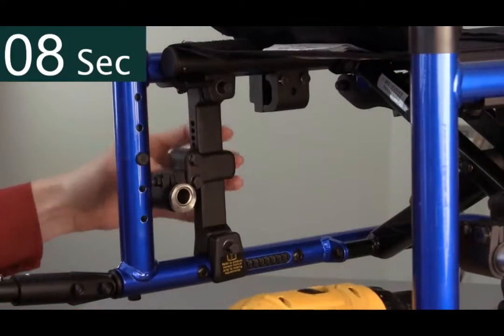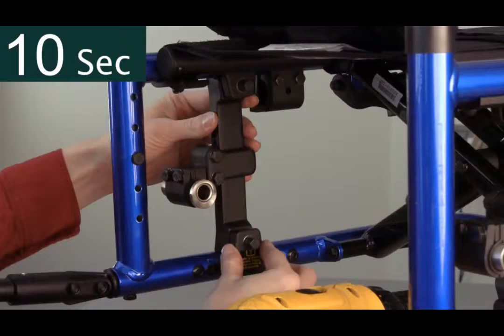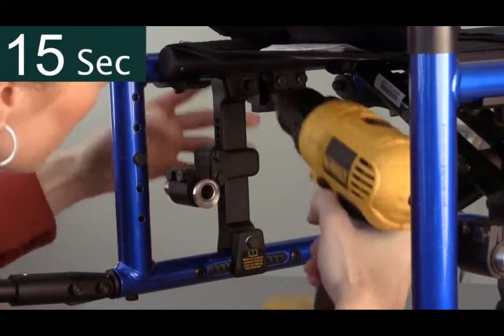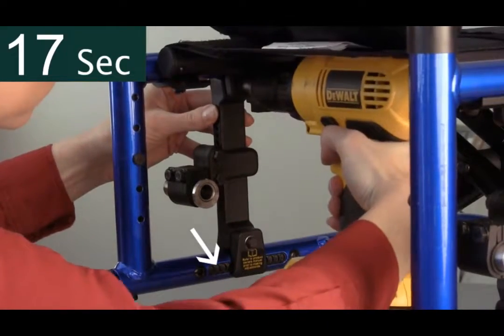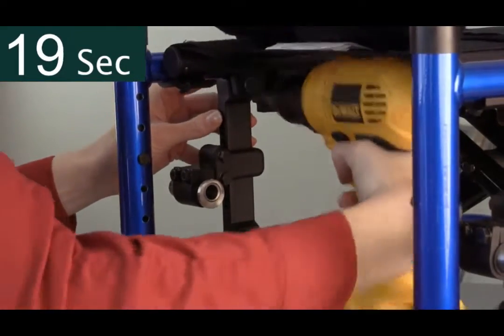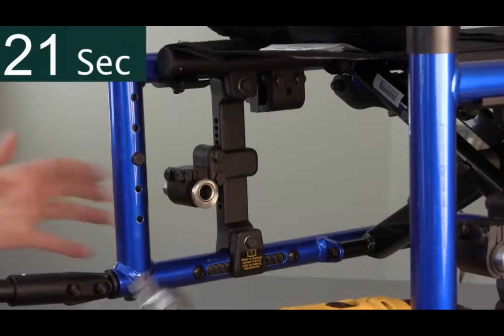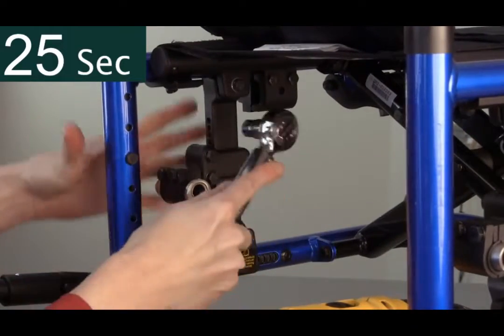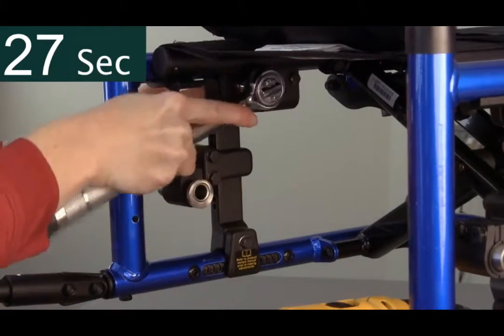Once loosened, the clamp is free to move on the upper frame and the indexed clamp is free to move on the lower frame. The indexed positions are in quarter-inch increments. Once the plate has been moved to a new desired position, re-tighten both bolts with a torque wrench and ensure that the clamp is on straight.